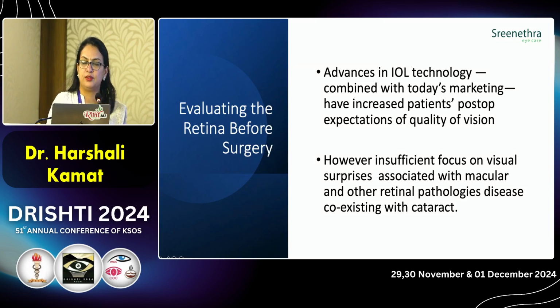There have been several advances in the IOL technology, and combined with today's marketing about cataract surgery, the postoperative expectation from the patient has increased markedly. There has been a good amount of interest in the postoperative refractive surprises, however, an insufficient focus on the visual surprises associated with macular diseases and other retinal pathologies coexisting with the cataract.